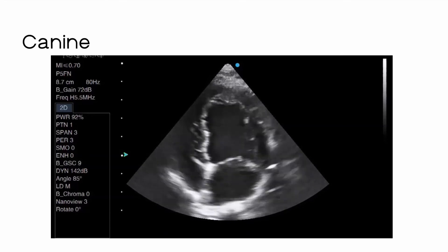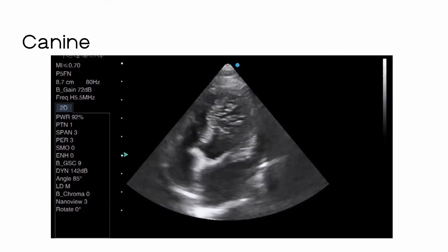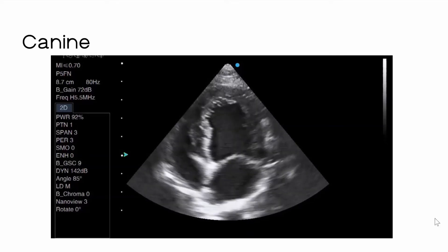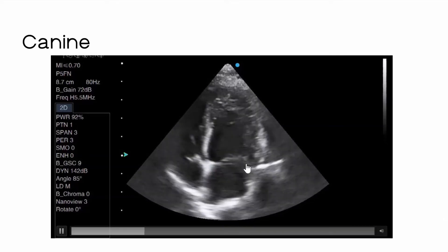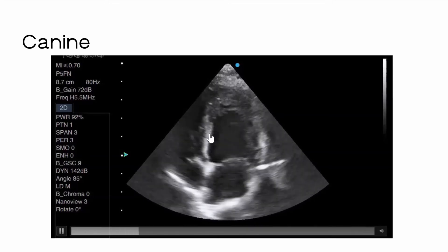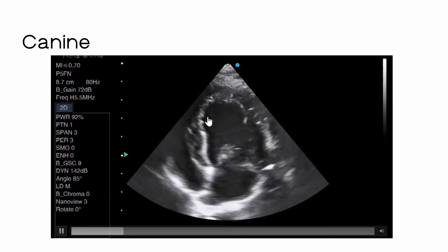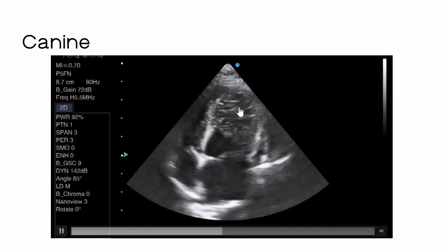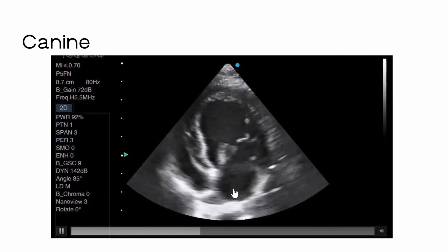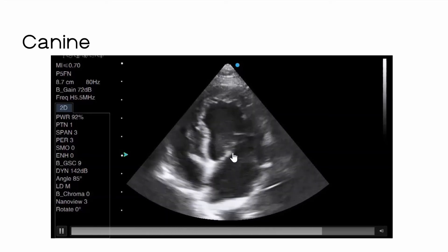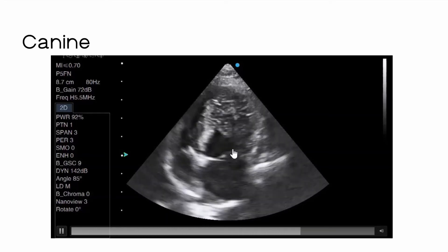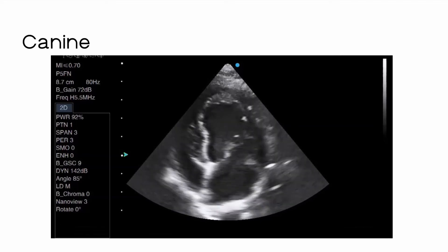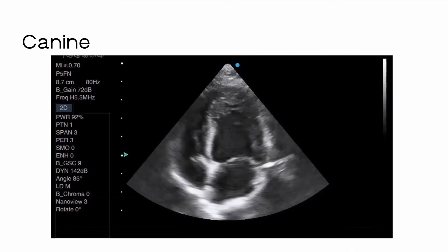Here's a left apical view. Even if you don't take these images yet, I'm sure you can still recognise where the left ventricle is — it's still going to be the larger, more muscular chamber. And once you've spotted that, you can work out what everything else is, even if the view is completely unfamiliar to you. So this must be the left atrium, because here's the mitral valve and blood is coming through into the left ventricle. So if you're ever a bit lost, identify the left ventricle and figure everything else out from there.